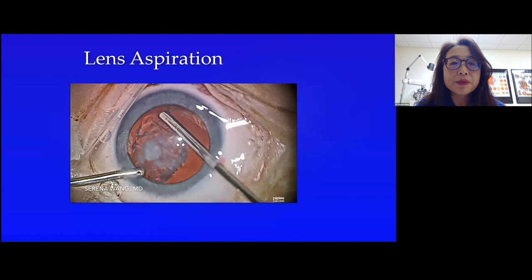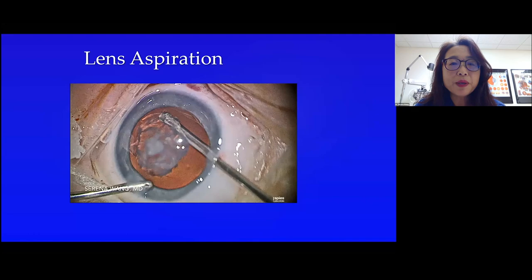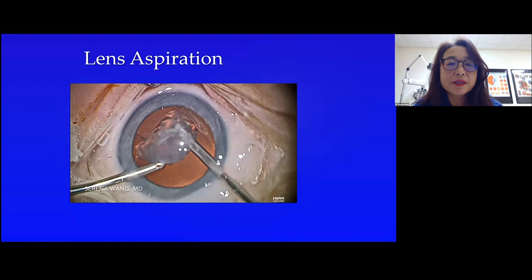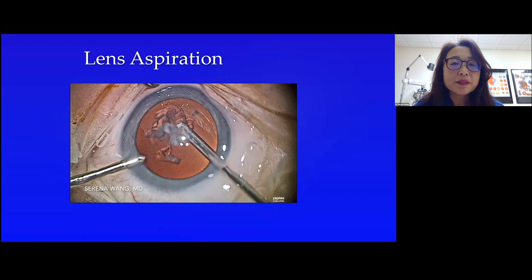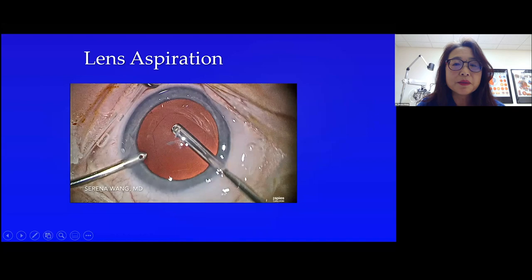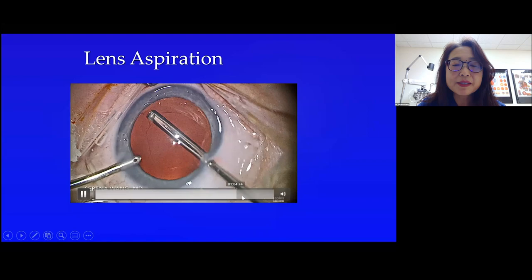I think whatever way works for you is the best way to do the pediatric cataract surgery or any kind of surgery. You will develop your own way and find the most efficient way to work with it. For this particular case, I take out the center, then do more on the periphery. It's very important you keep the periphery clean, make sure everything's clean before you move on to the next step.